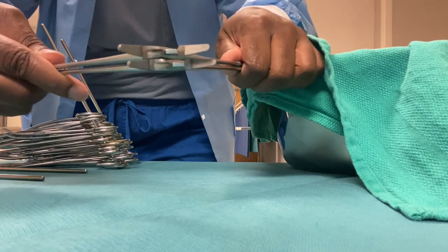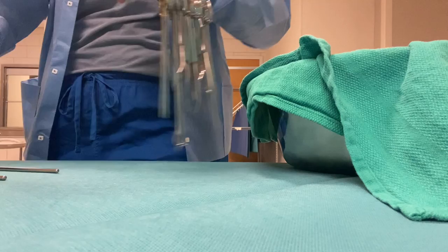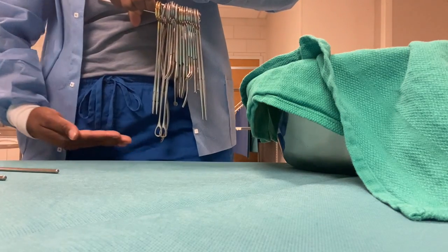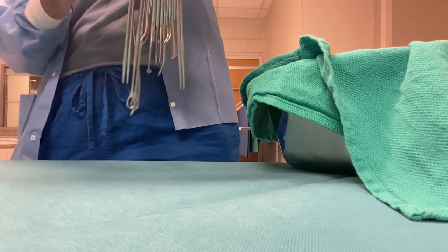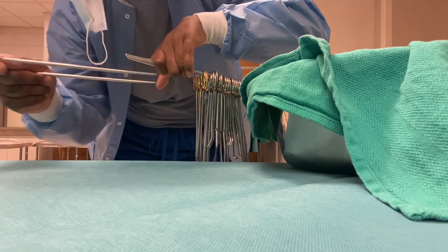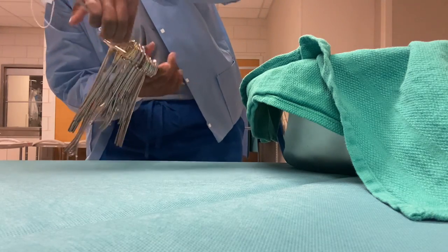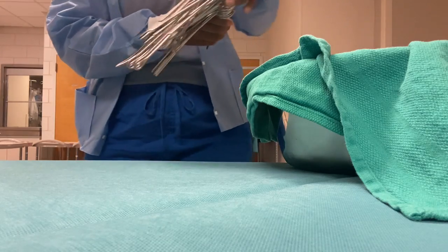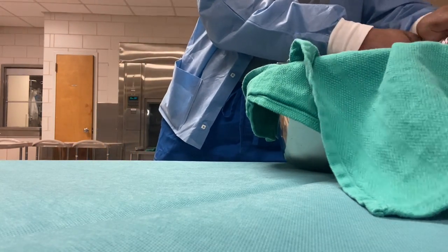I hope I'm showing y'all a good picture of it. Good video of it. So guess what? We're done. You see how the angled ones are all angled the same way. Now I'm just gonna scoot that. Now I'm just gonna take this one and scoot it in here. And secure that so they won't fall off, that's what that helps. And place it on top.